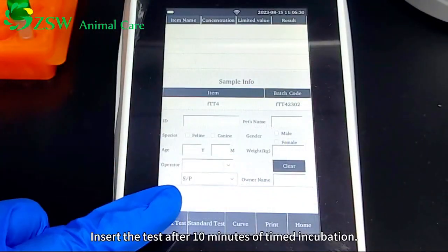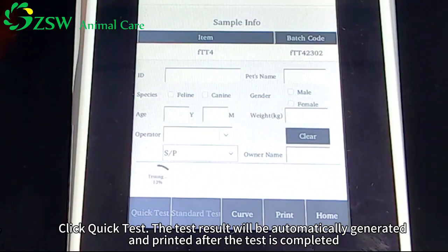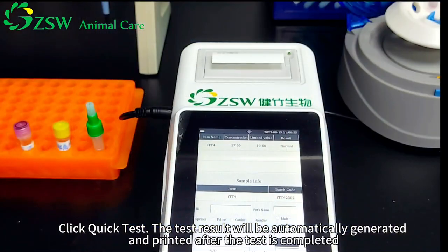Insert the test card after 10 minutes of timed incubation. Click Quick Test. The test result will be automatically generated and printed after the test is completed.